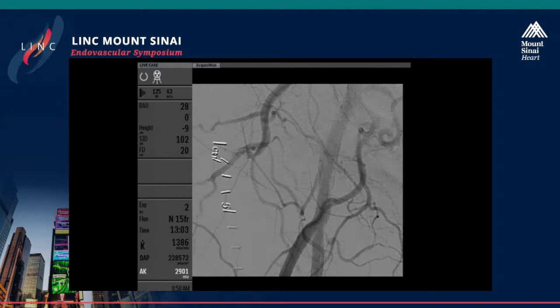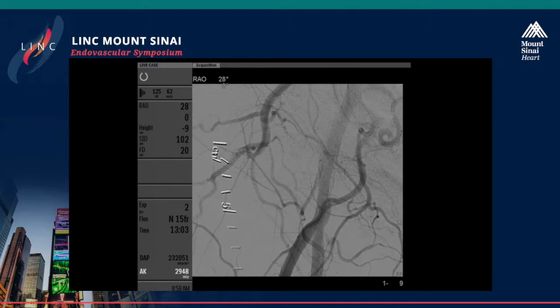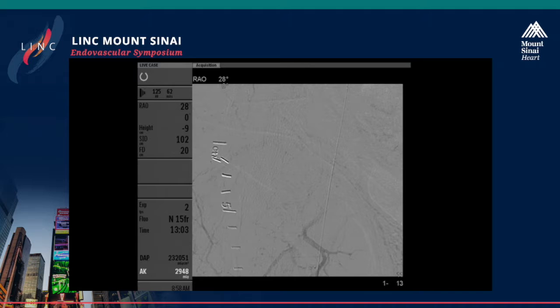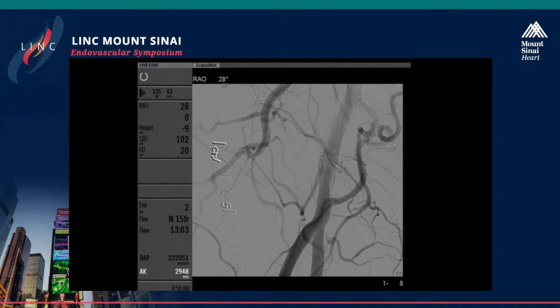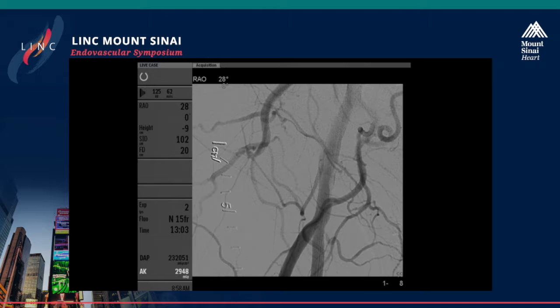So there we go. Is this acceptable, not acceptable? Do you leave this? Let me do an IVUS to give you more guidance. I think it looks good angiographically. I don't think you should touch it. I think you're done. And you could also put a small catheter down there, see if there's any pressure drop off with or without nitro, and that would kind of complete the picture.